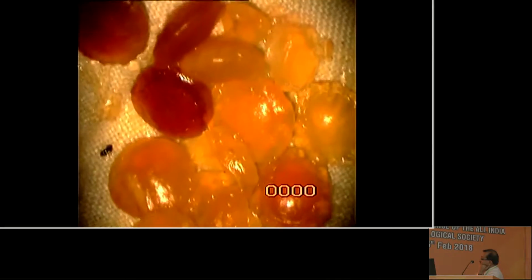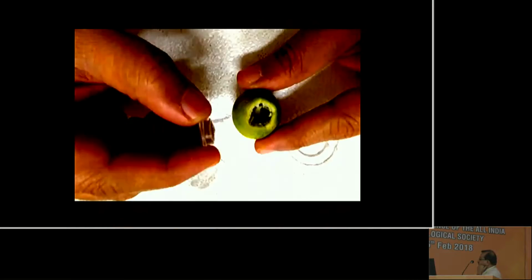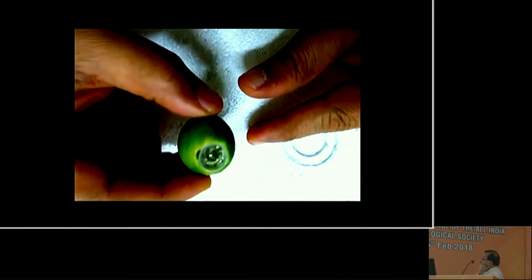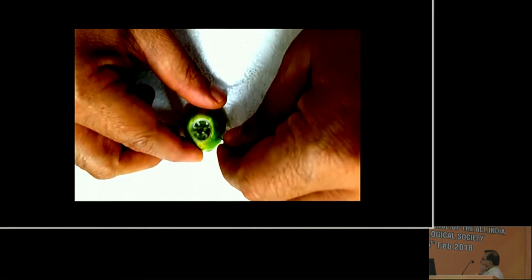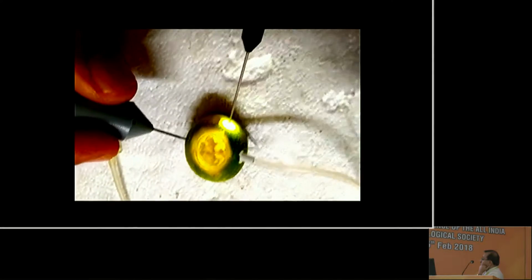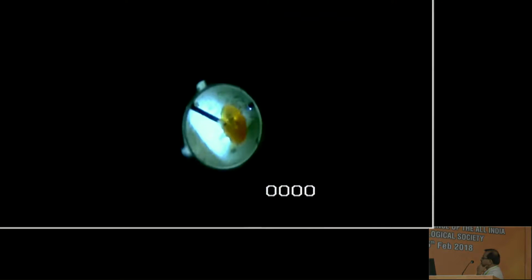Nuclei of varying degrees of hardness removed during SICS can be usefully harnessed. Placing these in a plastic ball or a small unripe lemon to simulate a model eye, and then trying out phacofragmentation can be a good initiation for the trainee vitreoretinal surgeon before embarking on real-life situations of dealing with dropped nuclei.